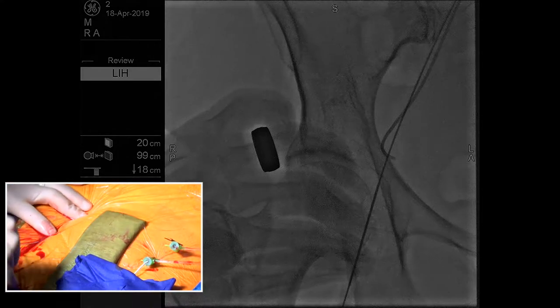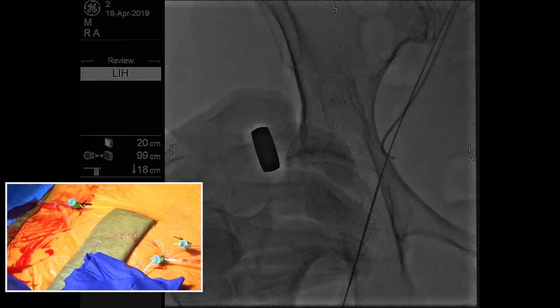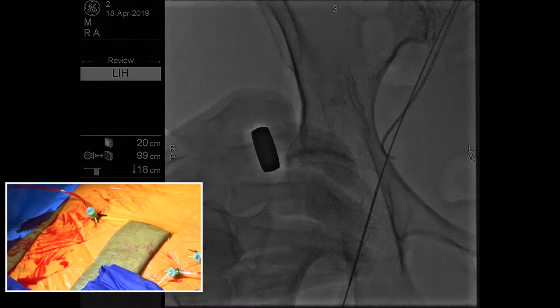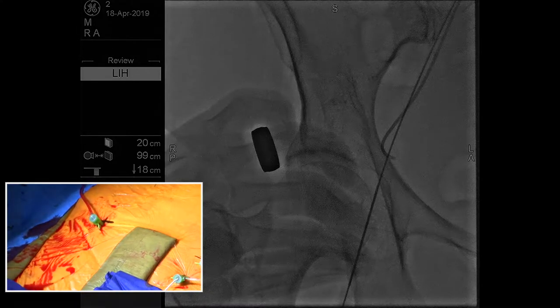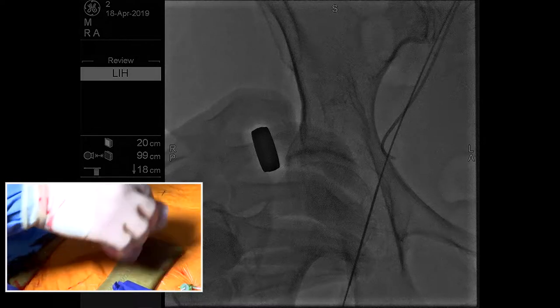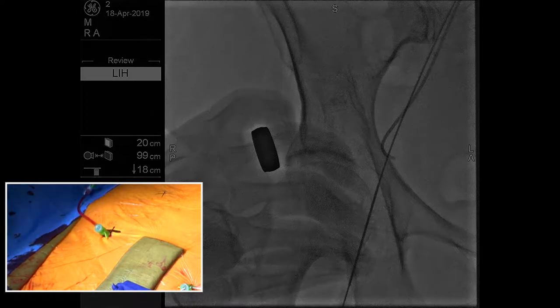Thank you. So now I'm just going to put my 6-French sheath in. I know we're in a proper location because we've directly visualized it. All right. So the next step, sorry about the blood here, is we're going to use the Perclose device to deploy those two sutures in the artery, and those are going to be deployed now.